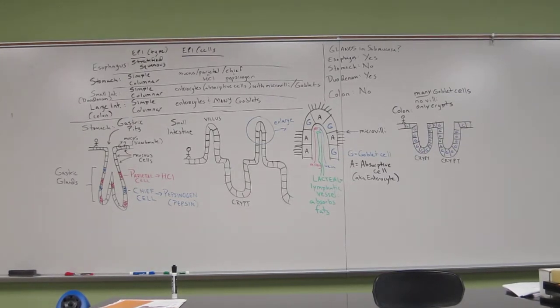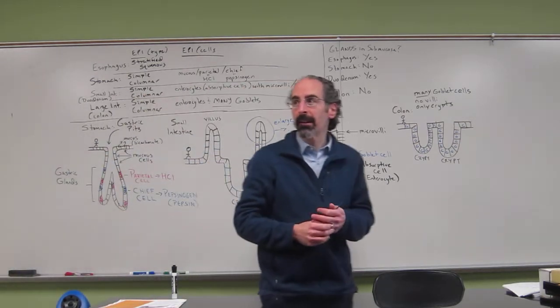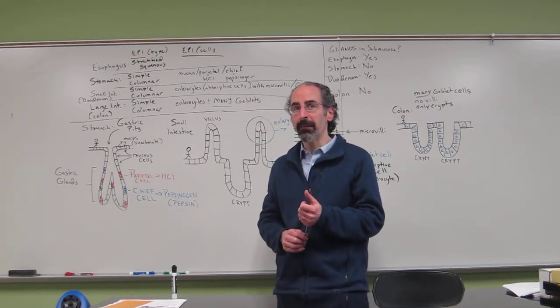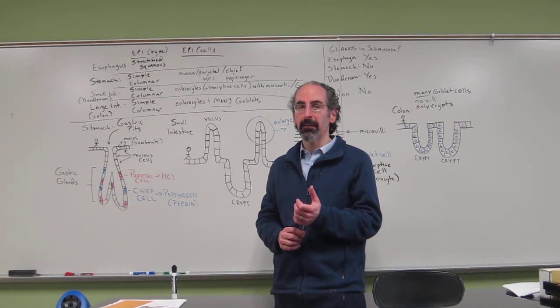Hello, this is Professor Nassar, and I'm here today to talk to you about the histology of the gastrointestinal tract. We will be looking at 4 representative slides of the gastrointestinal tract, of the GI tract.